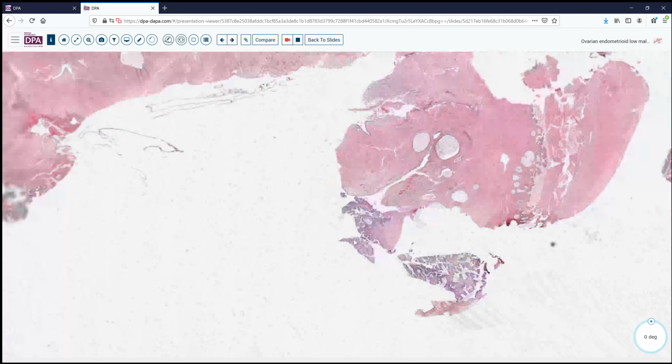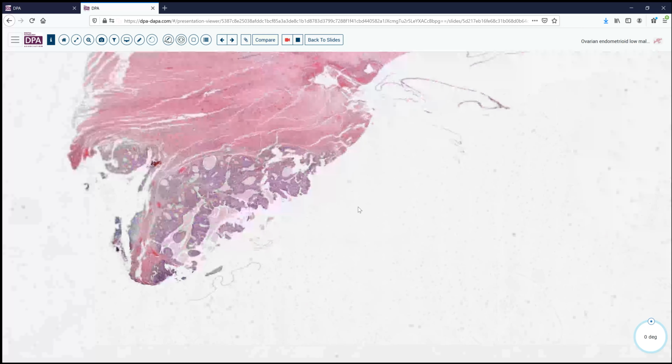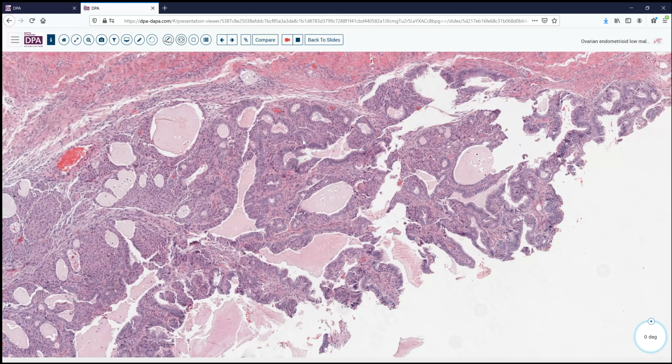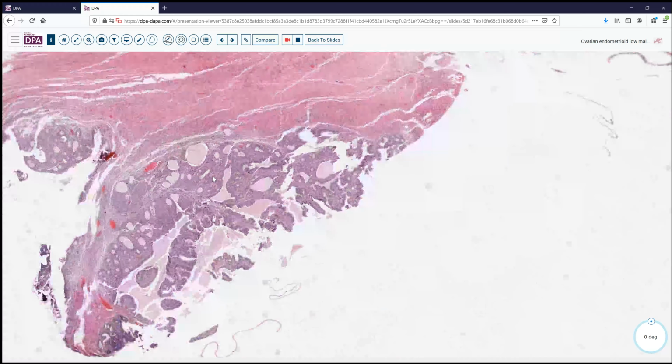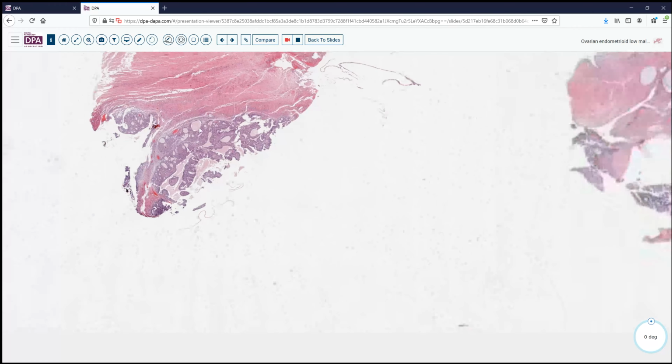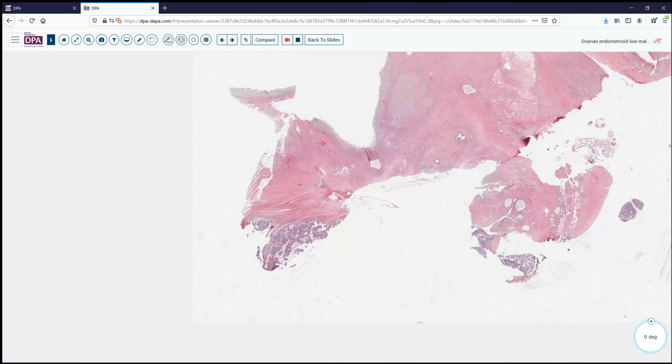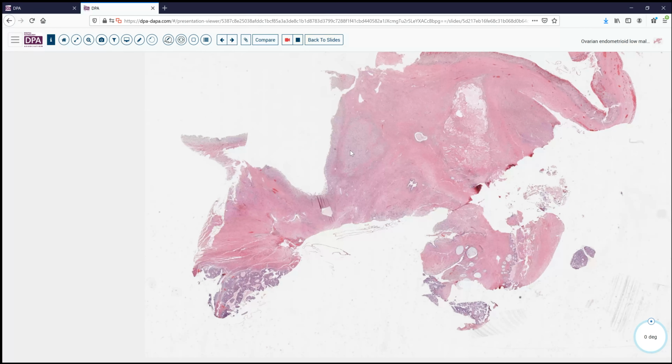So this is a nice example of a borderline endometrioid type tumor. And here we see even a little bit of squamous metaplasia that again tells us that this is endometrioid type, and its occurrence in an adenofibromatous setting fits nicely into that category of borderline endometrioid adenofibroma. These lesions would get some follow-up and monitoring to make sure that they did not have implants or have atypical features elsewhere. And so that's an important distinction to make.